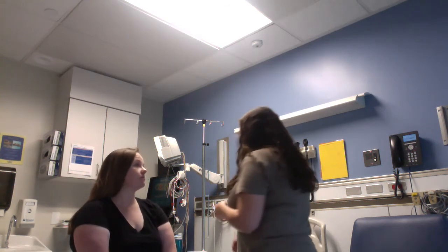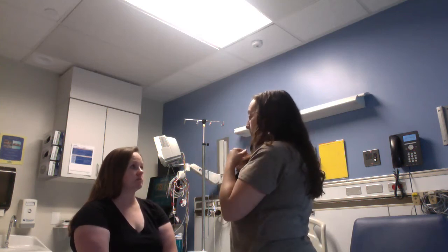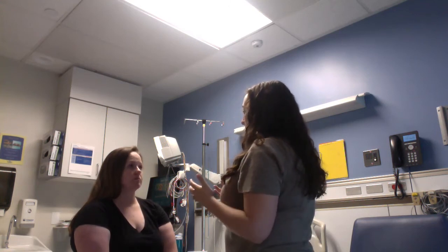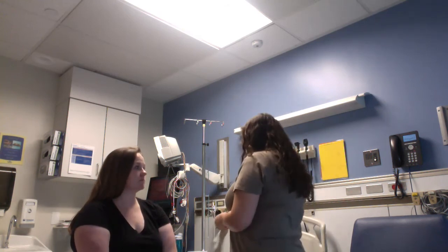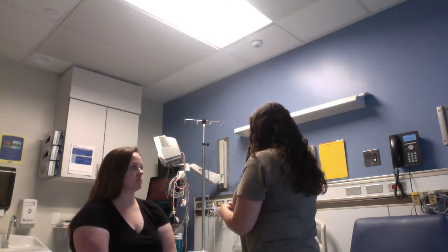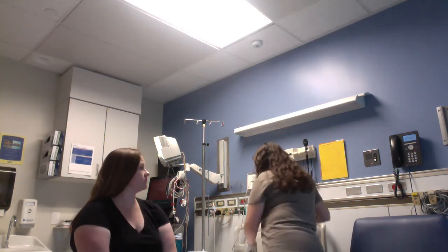All right. So now that we're done with the eyes and the ears, we're going to move on to the nose. With the nose, we're looking for any obvious deformities. We're going to take that otoscope again, Danielle, and check inside the nose for any abnormal discharge or any polyps. The mucosa in the nose should be pink.